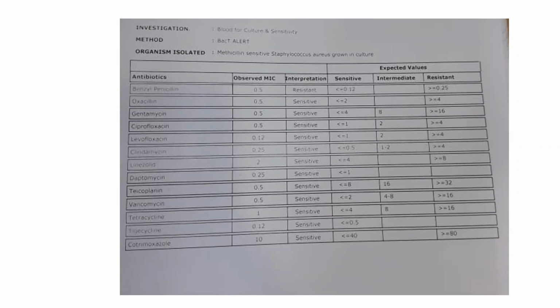See, it's both actually. Let's talk about, let's say, the blood culture. Once they see the positivity on the automated machine, they take a gram stain. So gram stain, it's easy. In 20-30 minutes, you can see whether it's gram positive or gram negative. And then once it's done, it goes to the agar plates, and then you plate it on different media like we discussed. So on those plates also, you can see the different morphology.